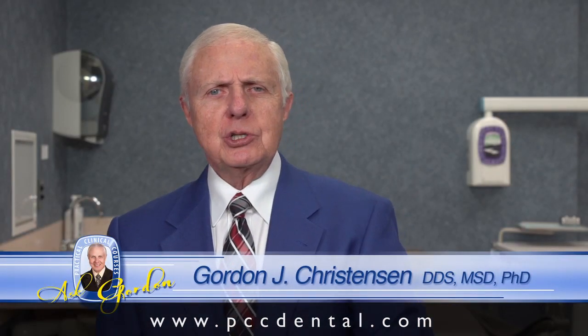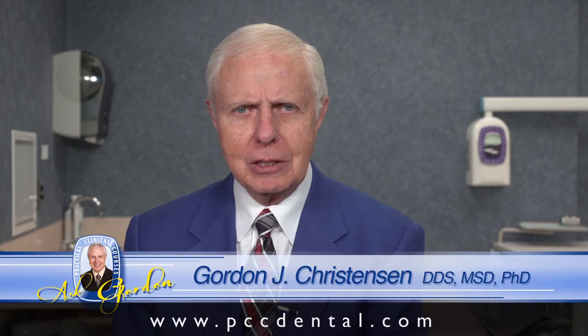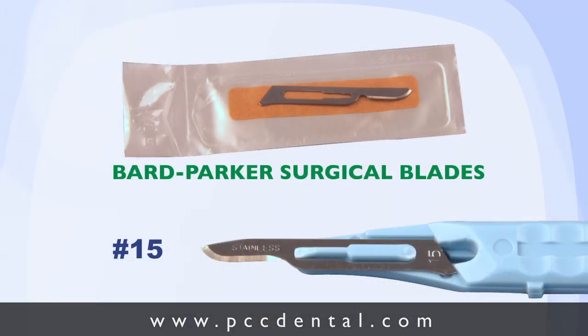That seems like a weird question — disposable scalpels. What in the world is that? Take a look. Here's a disposable scalpel on the bottom, and on the top is a blade to be put onto a handle, with which you can cut your glove or finger very nicely. And I've done it again and again.